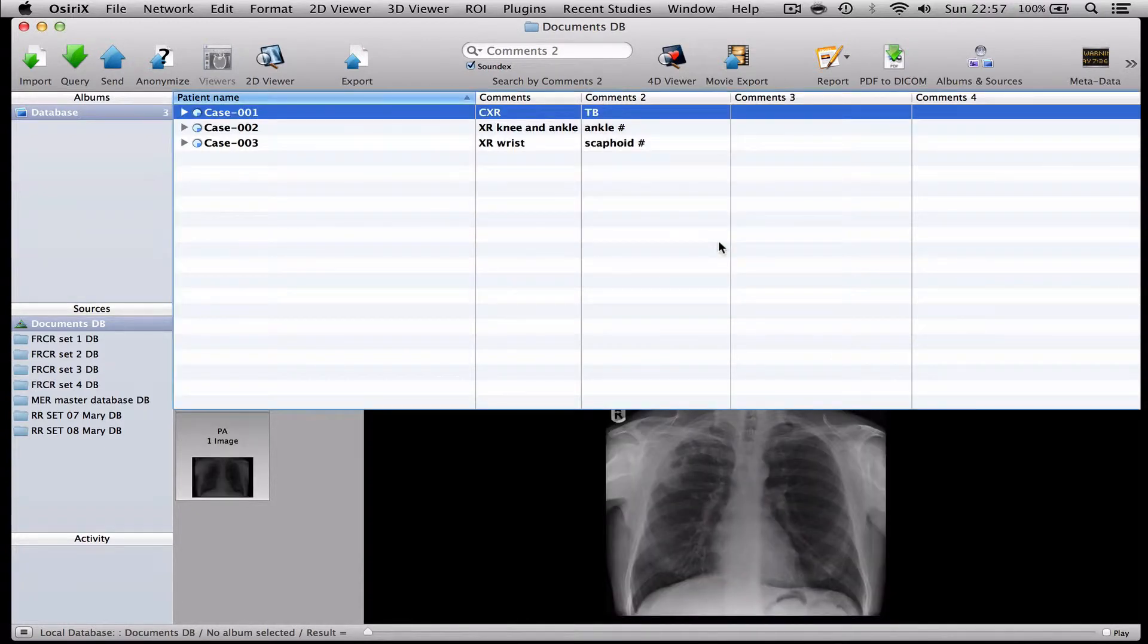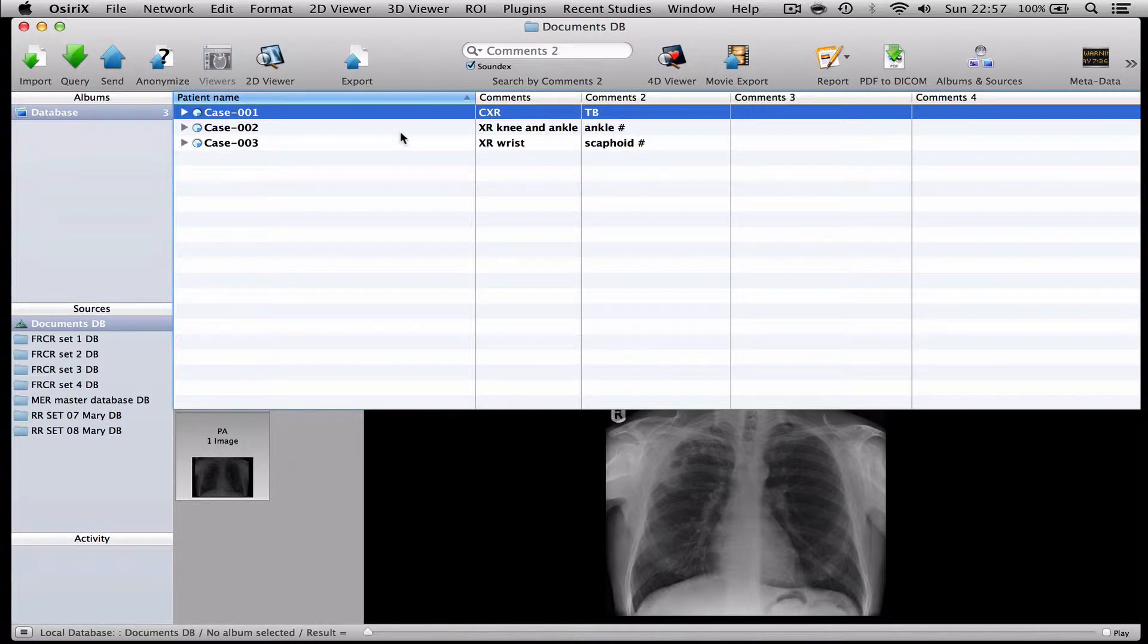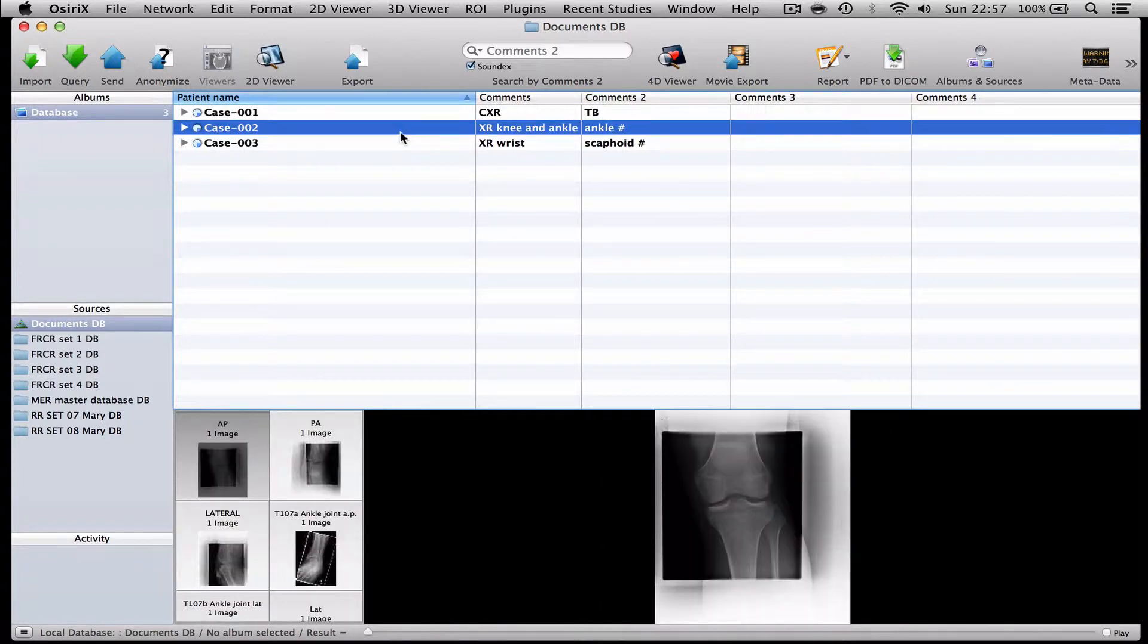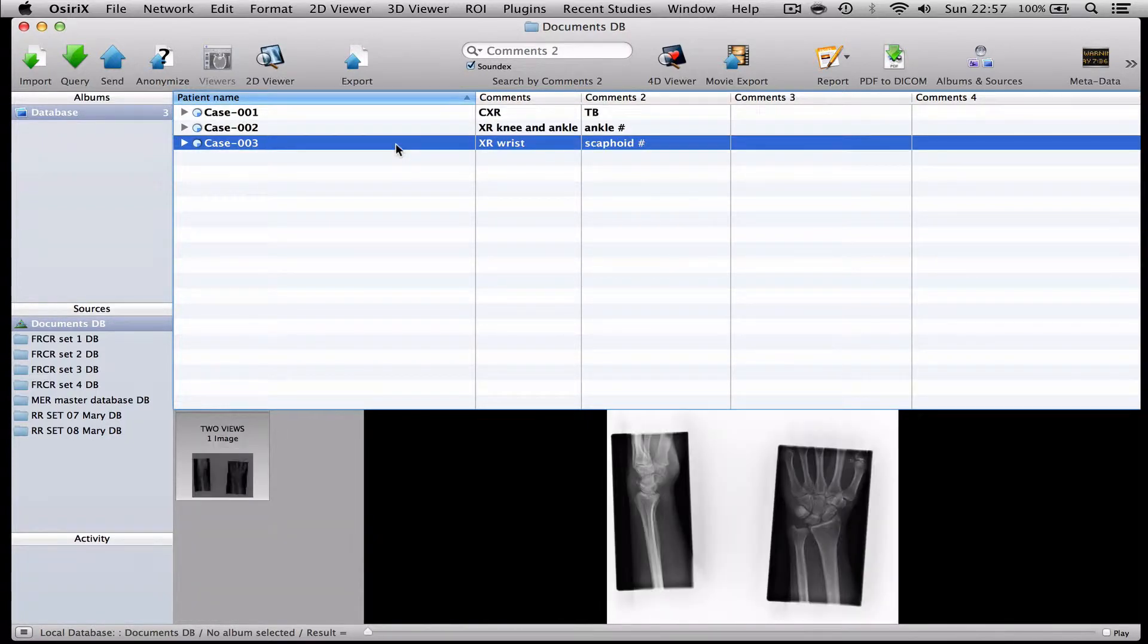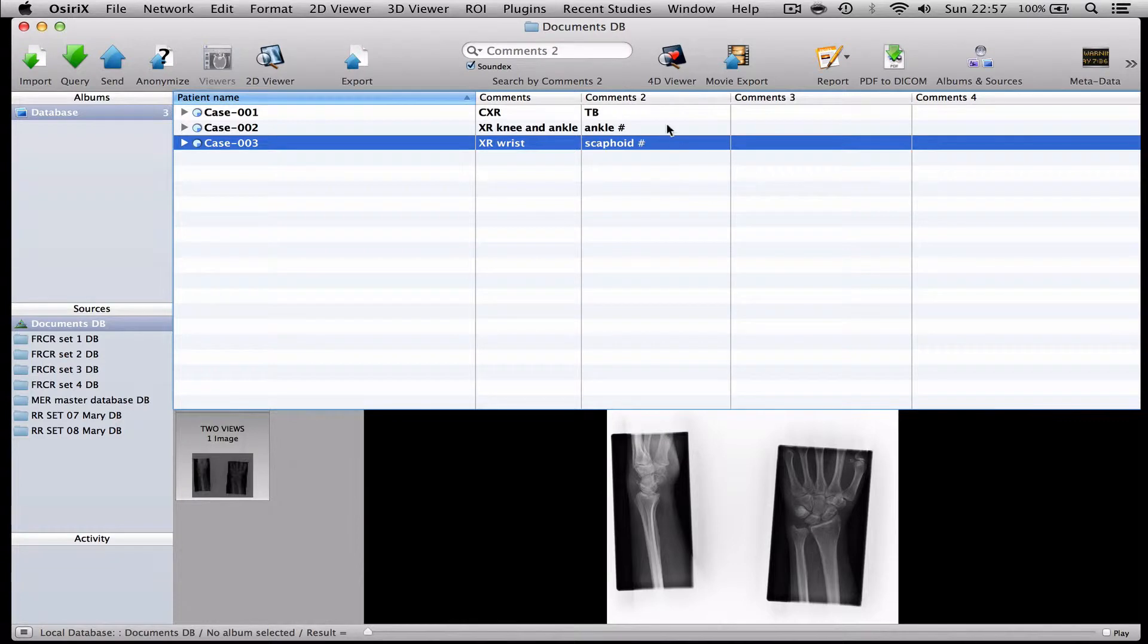So that's really nice and easy. I've got three cases, one of which has got two different sets of examinations. And these are all ready to send to my colleague. And I've annotated them with the answer. So what I need to do now is to create a new database to put these cases into that I can send to my colleague.